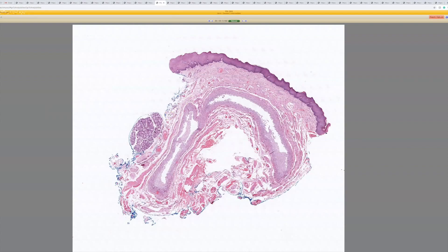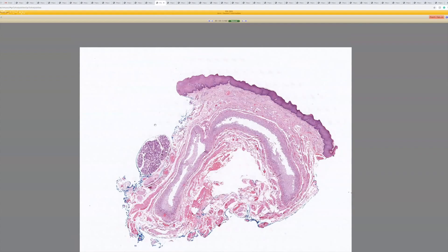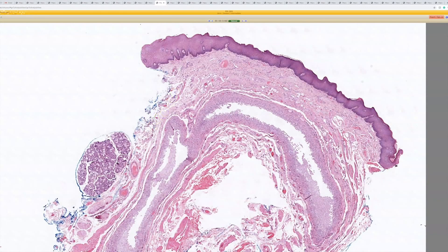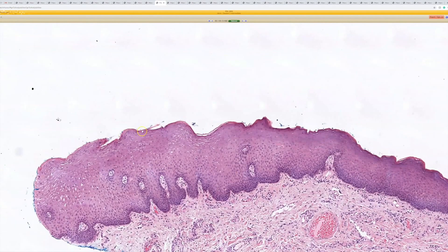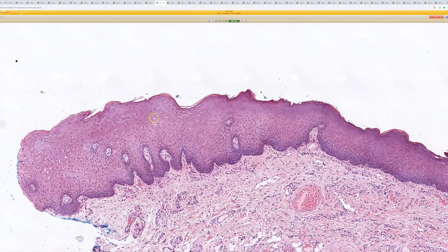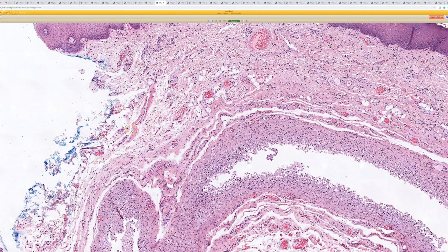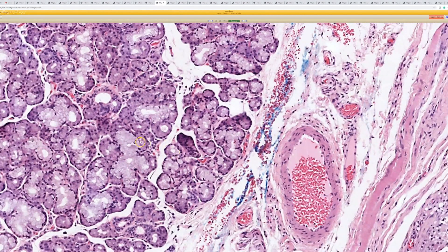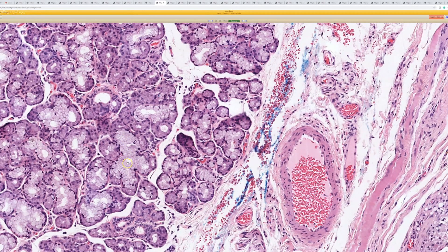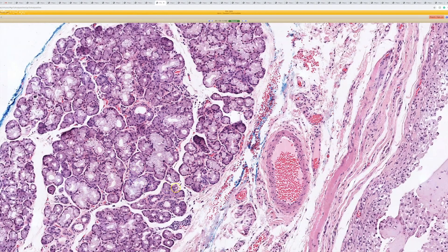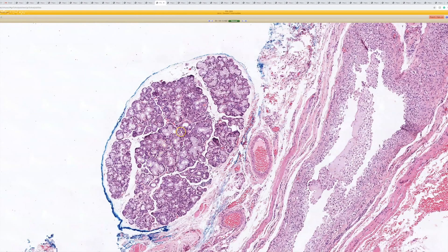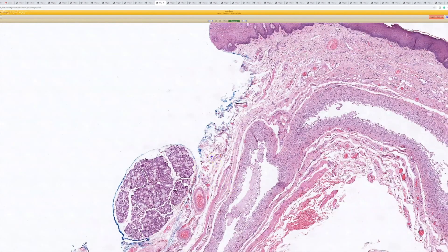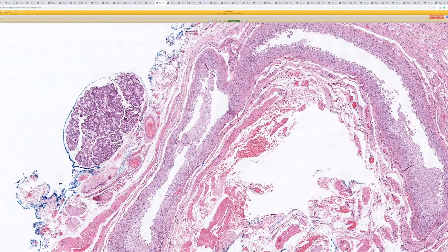That's not quite the right word — extravasation means coming out of a vessel — but mucous cyst is what I prefer. You're in the lip: stratified squamous epithelium without a granular layer, without a corneal layer, with that pale glycogenated look — that's mucosa. There's skeletal muscle, and this is a minor salivary gland, a small lobule of glands rich in mucin-filled cells that connect up to little ducts. The stratified squamous mucosa tells you you're in the mucosal lip.